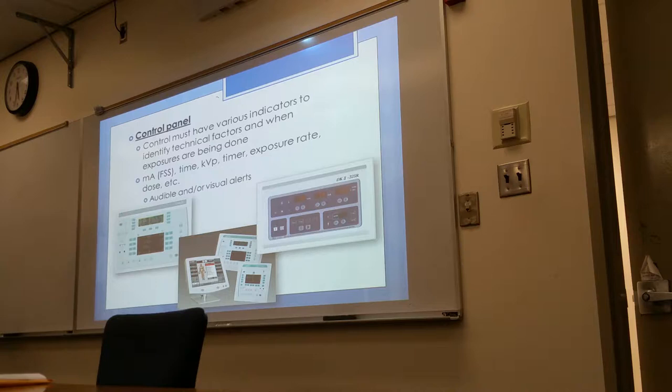Now, when you're making an exposure, there should be visual and auditory alarms going on, right? Have you guys already experienced that in the field? Okay, every time you make an exposure, there's usually some kind of blinking or flashing light, as well as an audible, okay? So those should exist. Any questions? Okay, these are all safety features.